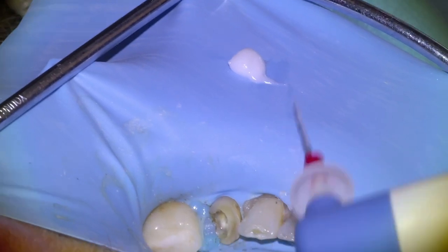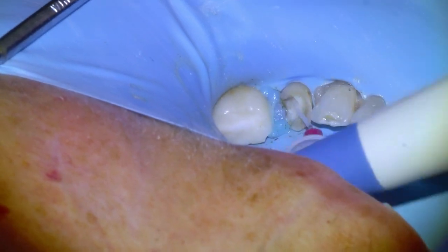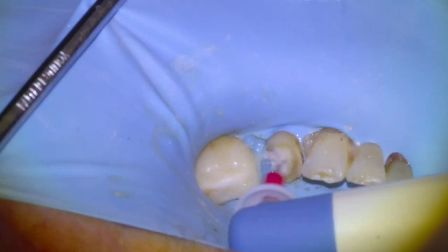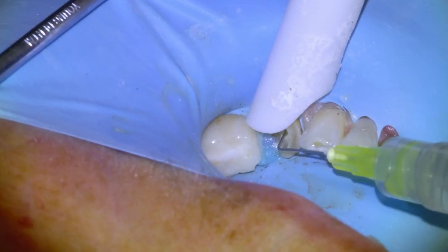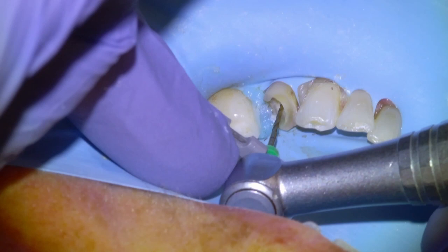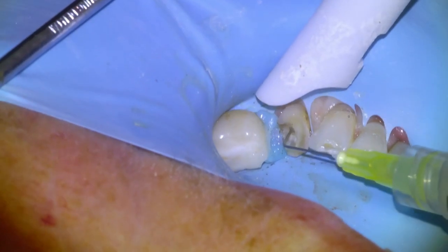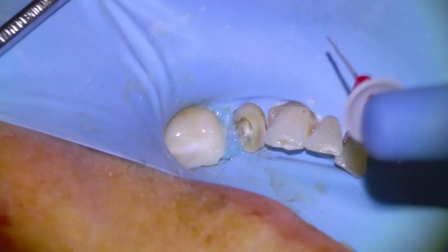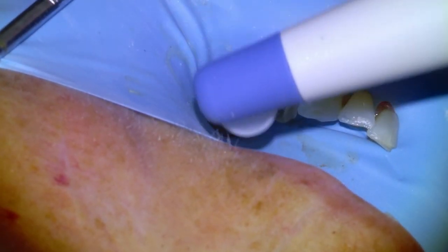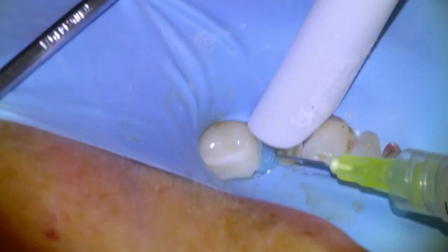I know some endodontists that like to use the endo activator between each file, but I find that using it for the last two is likely adequate for sterilization of the canal. I'll put a little bit of RC prep on the activator and give it a good shake for 15 seconds or so. Another irrigation, and then our final file — in this case we took a 35/04 down to the green line — and then we'll do a final irrigation and endo activation for a good 15-20 seconds to sterilize the canal.